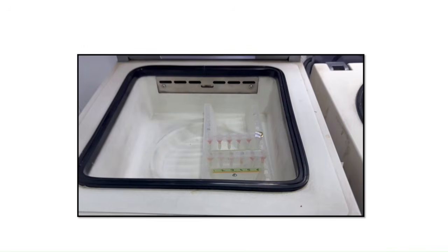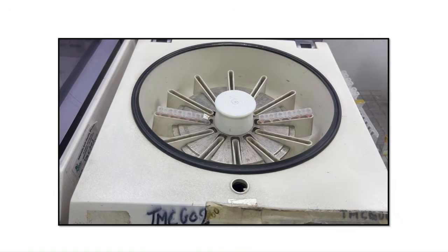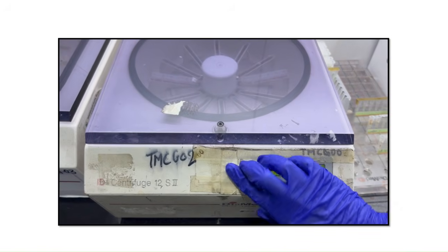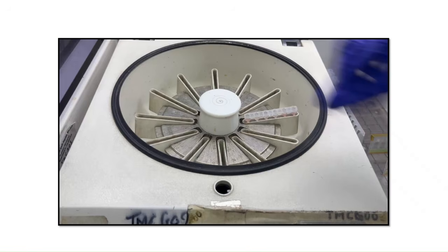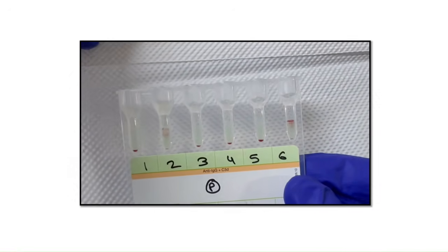Then incubation at 37 degrees Celsius for 15 minutes. Then centrifuge for 10 minutes after incubation. So this is the result we obtained after centrifugation.